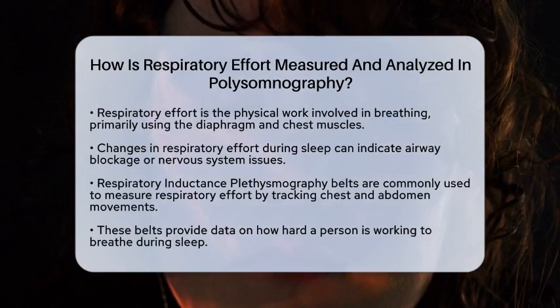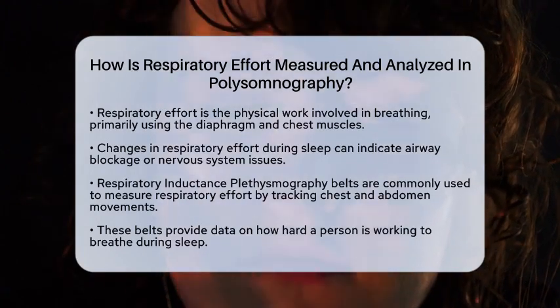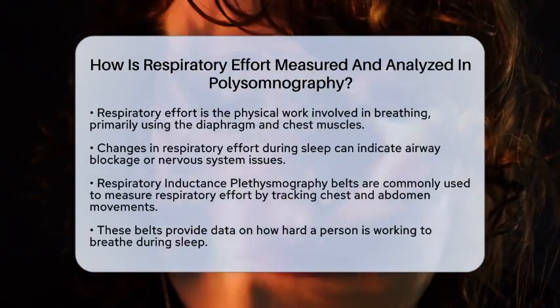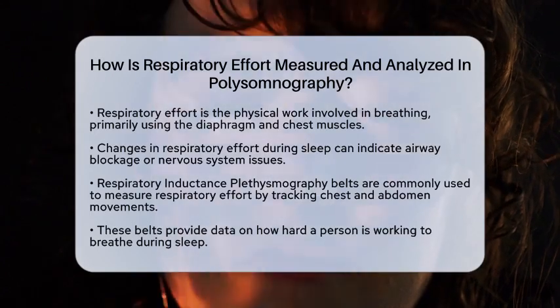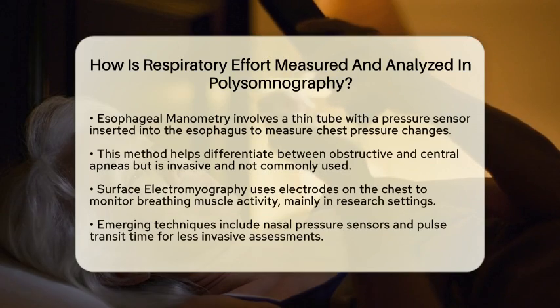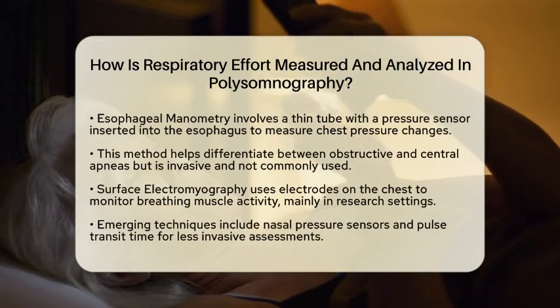These elastic bands are placed around your chest and abdomen. They track how your body expands and contracts while breathing. The data from these belts show how hard you are working to breathe, making them a standard tool in sleep studies. Another method is esophageal manometry.